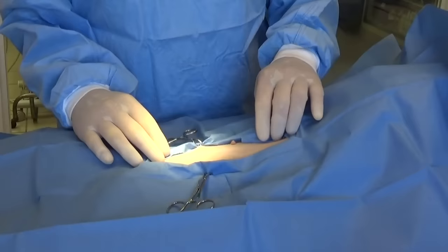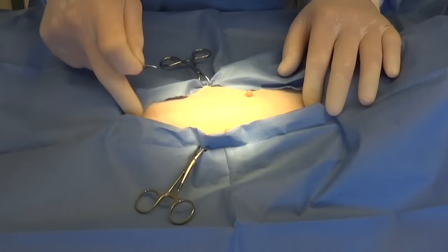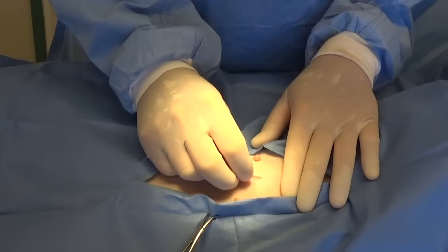It's all prepped up. I didn't show the prep. I was negligent showing that, but we scrub the incision multiple times with antiseptic. Hold your breath, close your eyes, don't look. This is the cut. Are you up nice and close, Melissa? I'm up nice and close.